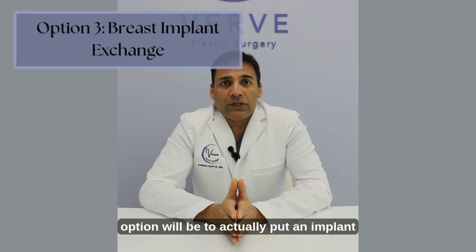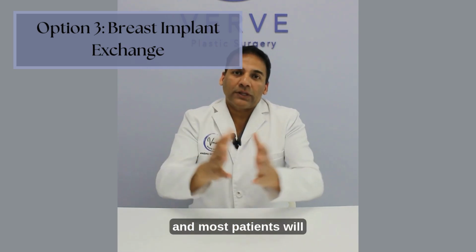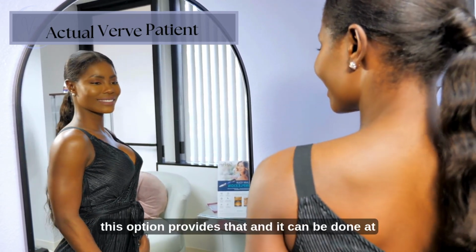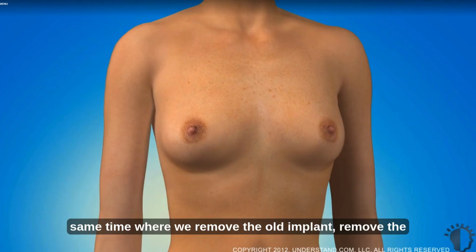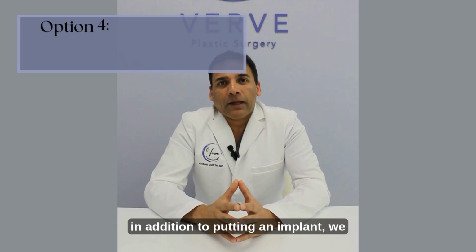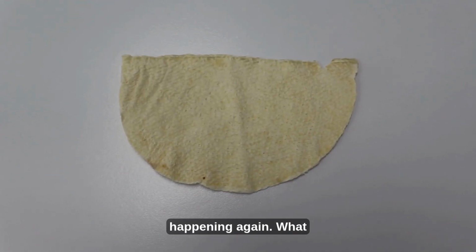The next option will be to actually put an implant back in, maybe with or without the lift. That will once again give you the top fullness. And most patients will want to have their aesthetic look back. So at least this option provides that. And it can be done at the same time, where we remove the old implant, remove the capsule, and put a new implant in. Now, the final option is, in addition to putting an implant, we also put a small graft to prevent this problem from happening again.